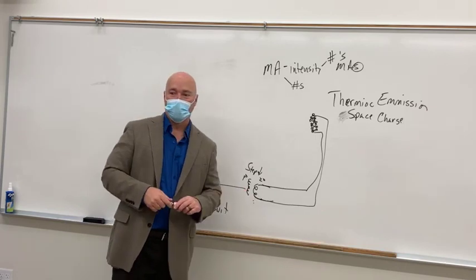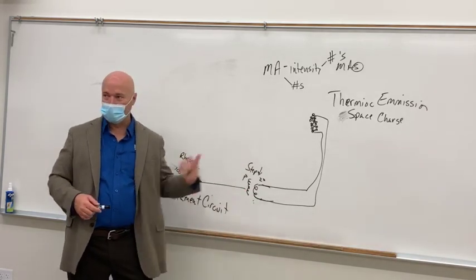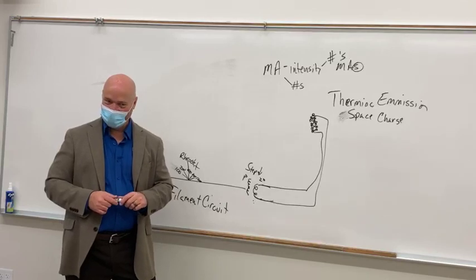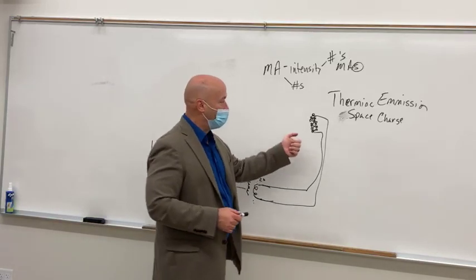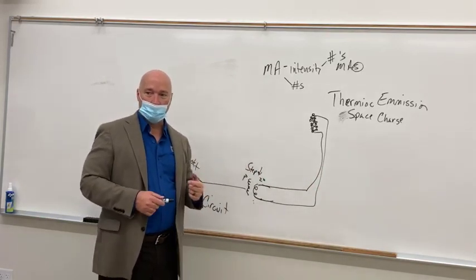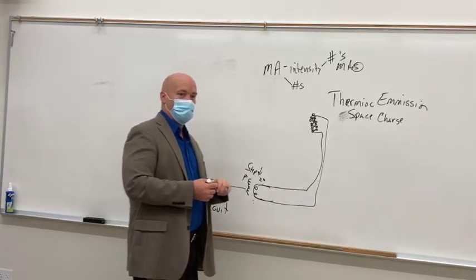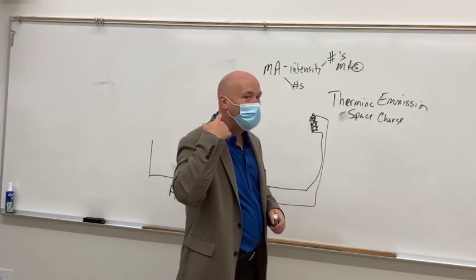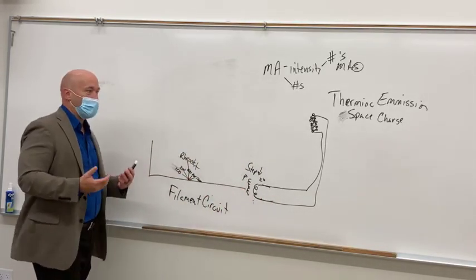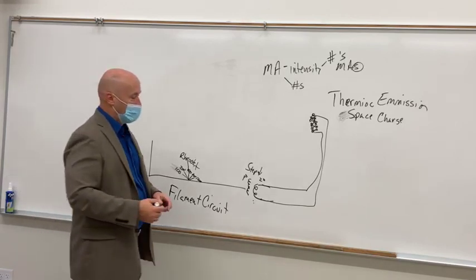When do we get exposure? What do we have to apply to make them jump? Okay, so you got prep, you make exposure, what makes them go? Electricity, yeah, it is electricity, KVP. Okay, they don't jump across until the voltage gets high enough.